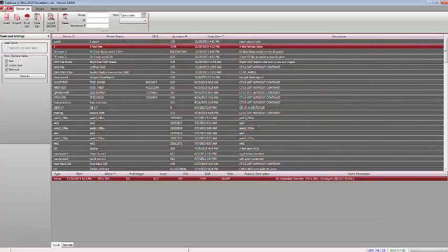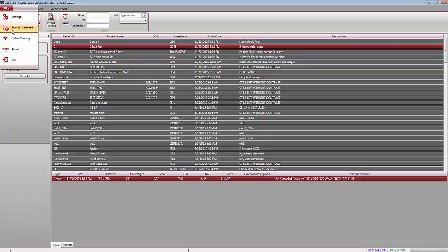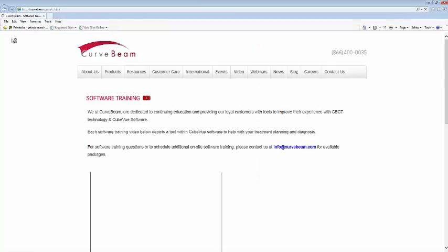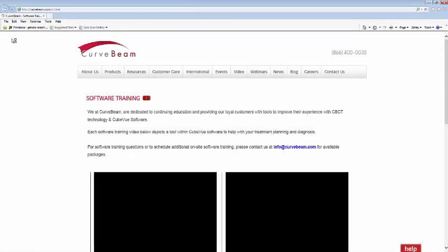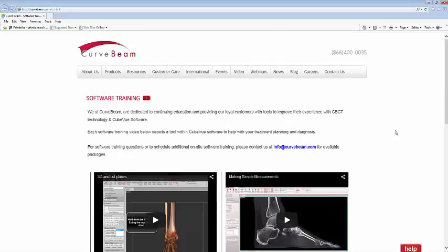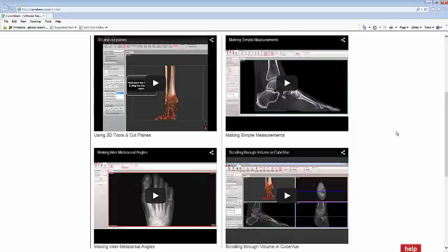First off, if you go to the upper left corner, you'll see a new item here: Online Training. You must have internet access to use this feature. When you click on it, a link opens up to the CurveBeam Software Training webpage, and you'll be able to view the different videos we have prepared to teach you the basics on how to use CubeVue software.